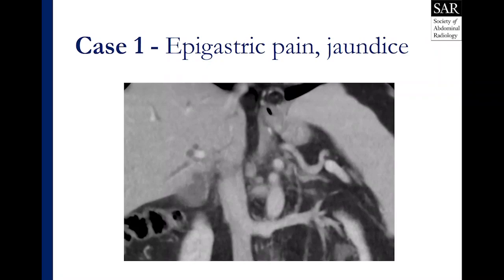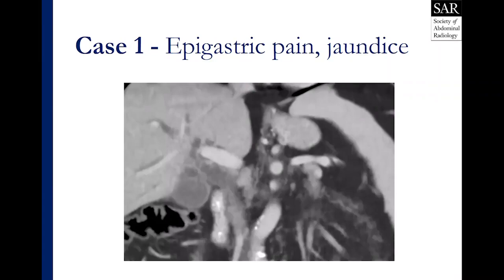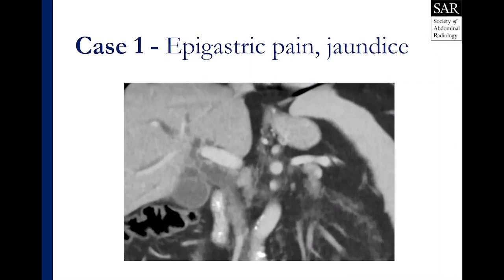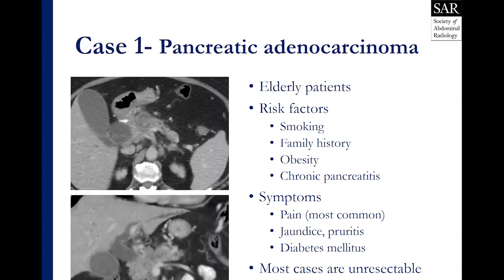Here is case one. It's a patient with epigastric pain and jaundice, and here we have a video clip of a coronal post-contrast CT. Many of you have seen something like this before. You know this as a classic example of pancreatic ductal adenocarcinoma, or PDAC.